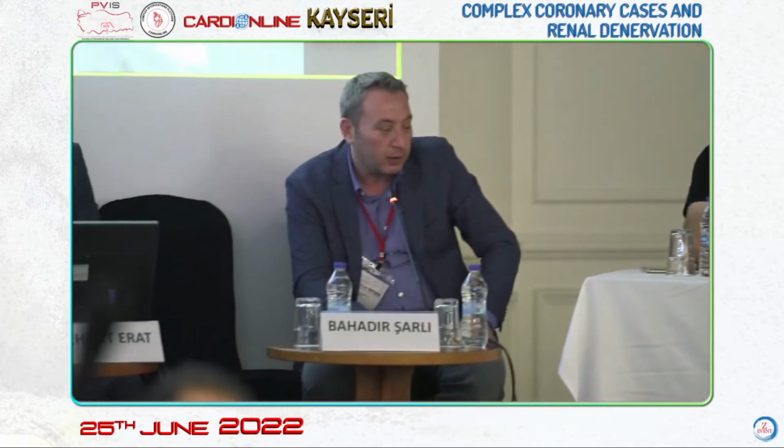All the side branches. Should we wire all the side branches? Which side branches should be wired? I asked a question for discussion. According to me, all the side branches above 2 millimeters should be wired, but I'm curious about your experience. Even the septals I'm trying to wire.